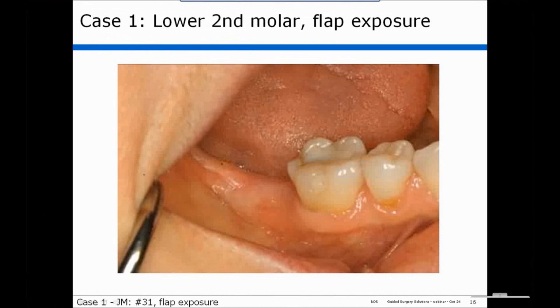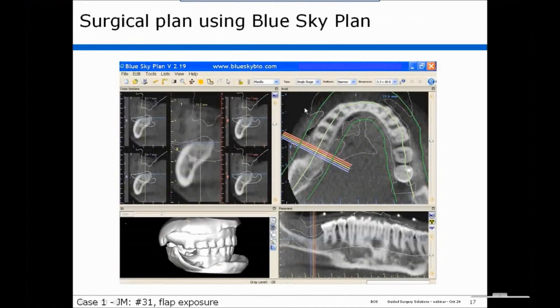This is a lower second molar with flap exposure. The first thing we have to do is plan the case. When you open up Blue Sky Plan, you'll see this screen with your cross-sectional screen, your axial screen, panoramic screen, and the 3D screen.